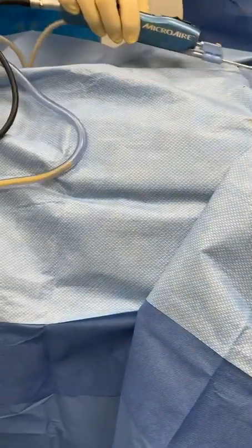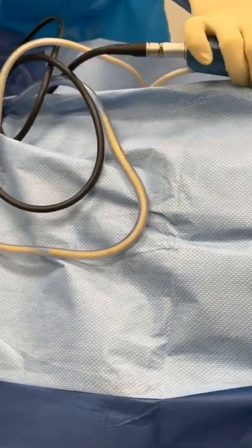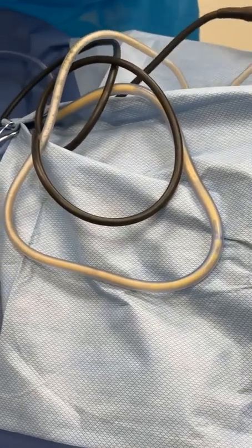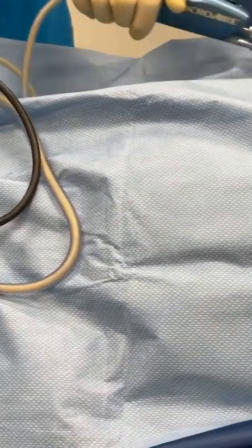And can you show and see what is coming out when we are doing this procedure? And notice how, what color is that, Elena? It's yellow. Yellow, beautiful fat. Beautiful, right? And notice that my strokes are very, very slow.